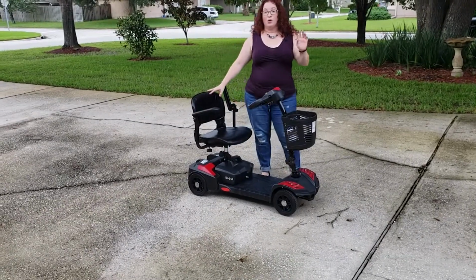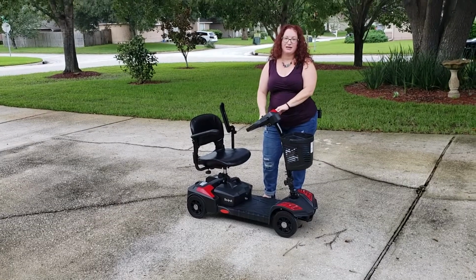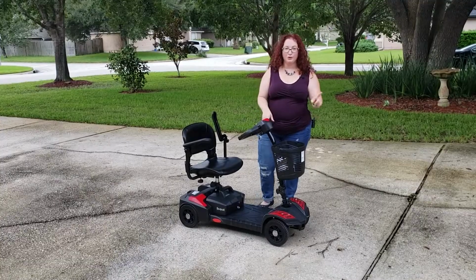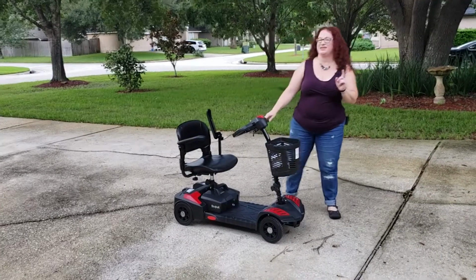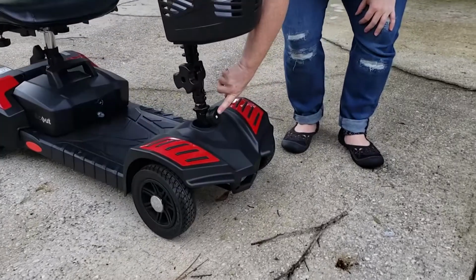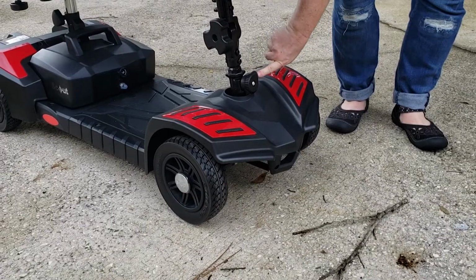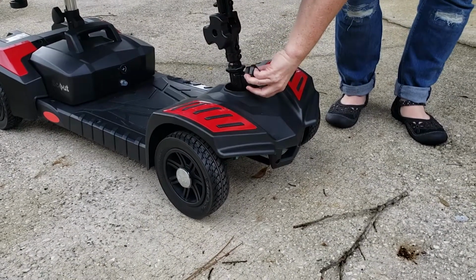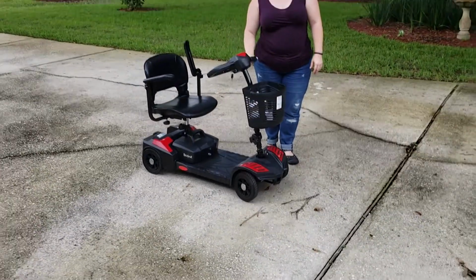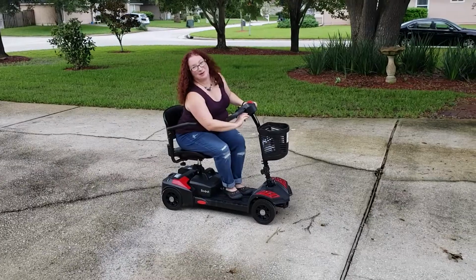So one last thing I want to make sure we do, if you see this, the wheels aren't turning. So in order for me to really be able to go and turn corners, I have to do this last part that's easy to forget. Here's the steering, the wheel lock knob. This just pulls out and turns up, and now you have full range of motion with your wheels. So I'm all set again to go back to riding.